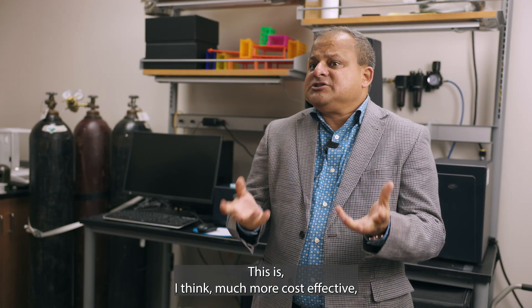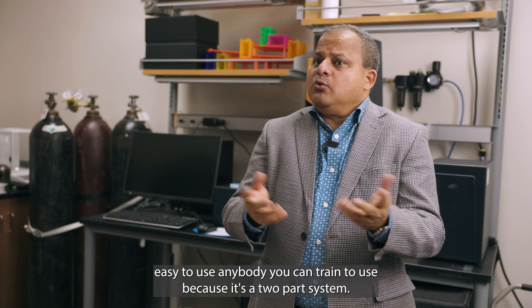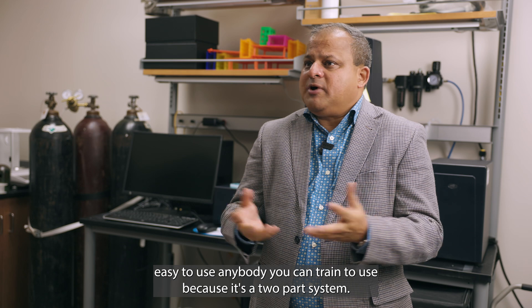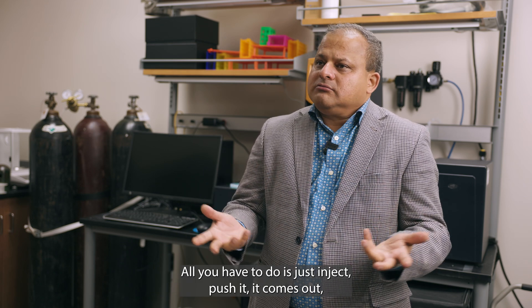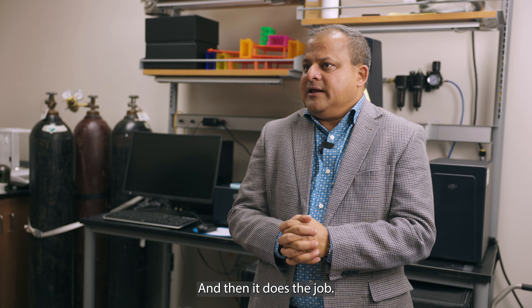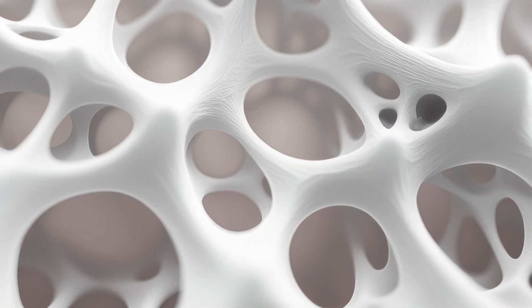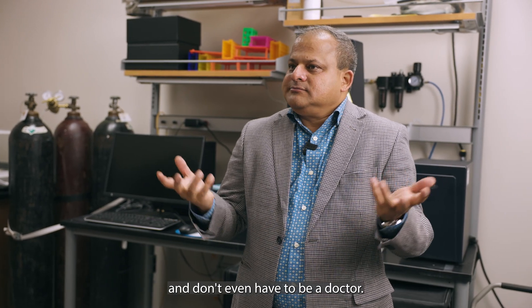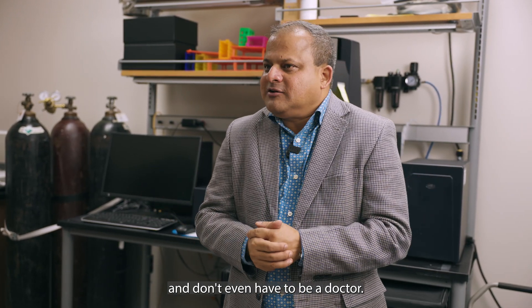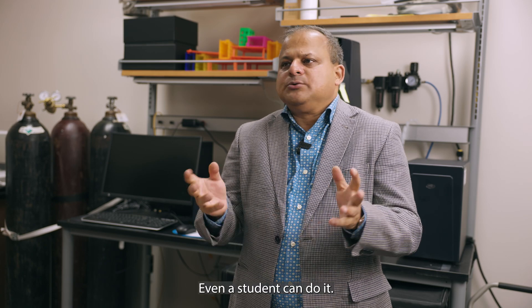This is much more cost-effective and easy to use — anybody can be trained to use it because it's a two-part system. All you have to do is inject it, push it, it comes out, nothing else needs to be done, and then it does the job. After 30 minutes or one hour, anybody can take the foam out slowly. You don't even have to be a doctor — the training process is extremely easy. Even a student can do it.